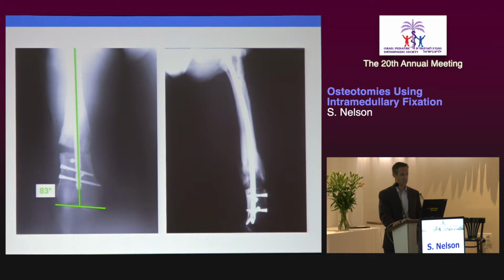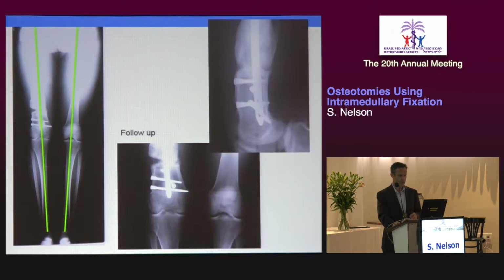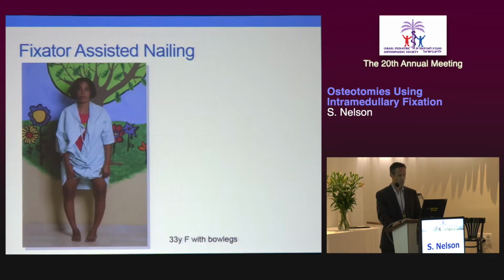Having an intraoperative sterile goniometer can also be very helpful in these cases. And here we corrected the anatomic axis to 83 degrees, and that matches nicely with the proximal tibial angulation in order to create a straight mechanical axis. And then the bone fills in, as we've seen this morning in a number of pictures from Mark's talk.